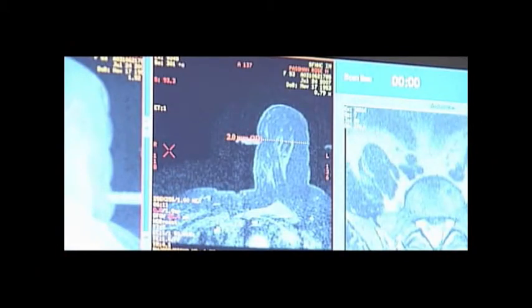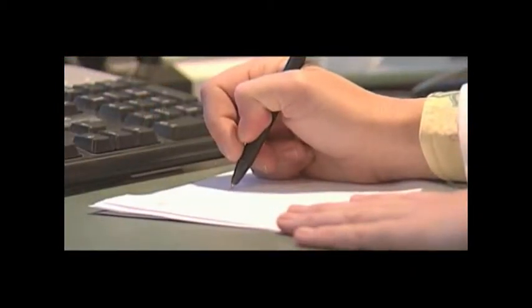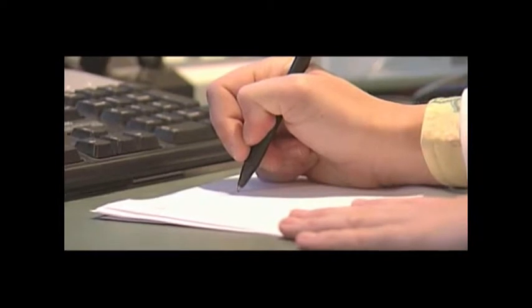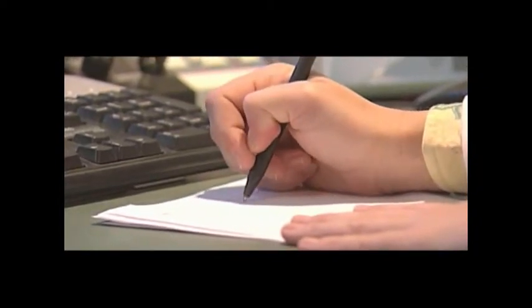Count the number of slices from the fiducial image to the lesion image. Multiply the number of slices by the slice thickness. This is the X value and the distance the pillar will move in the horizontal direction. Record this value.